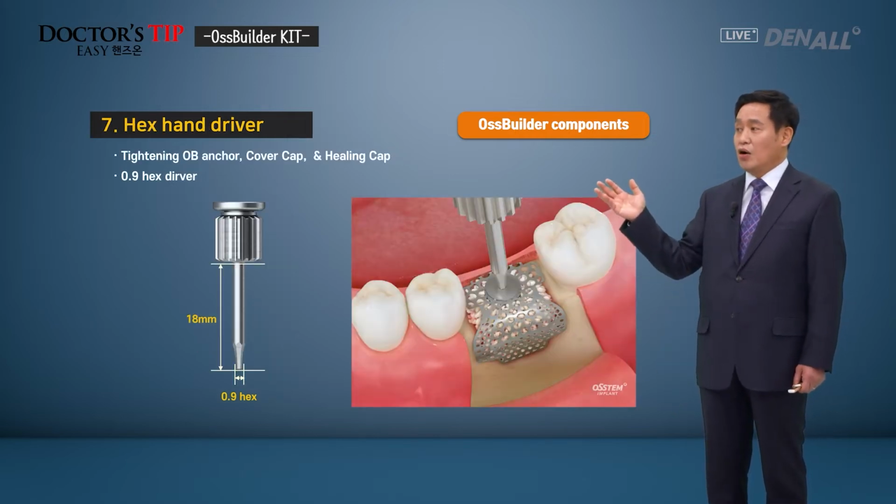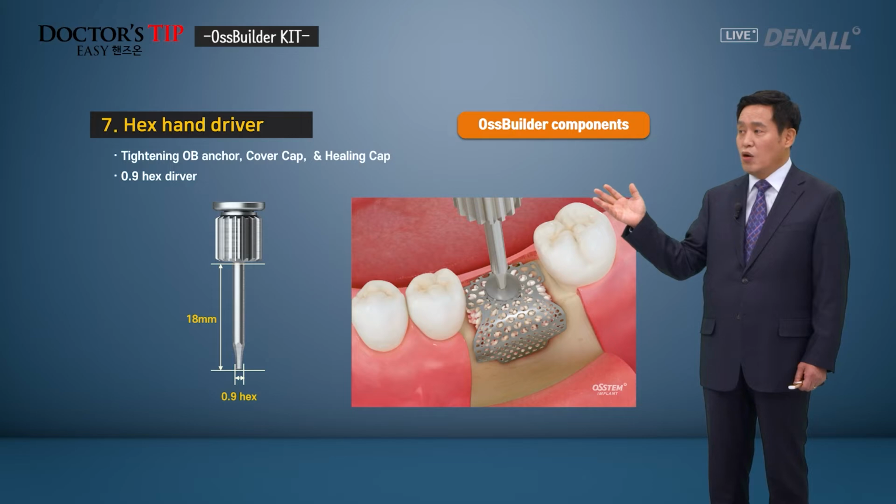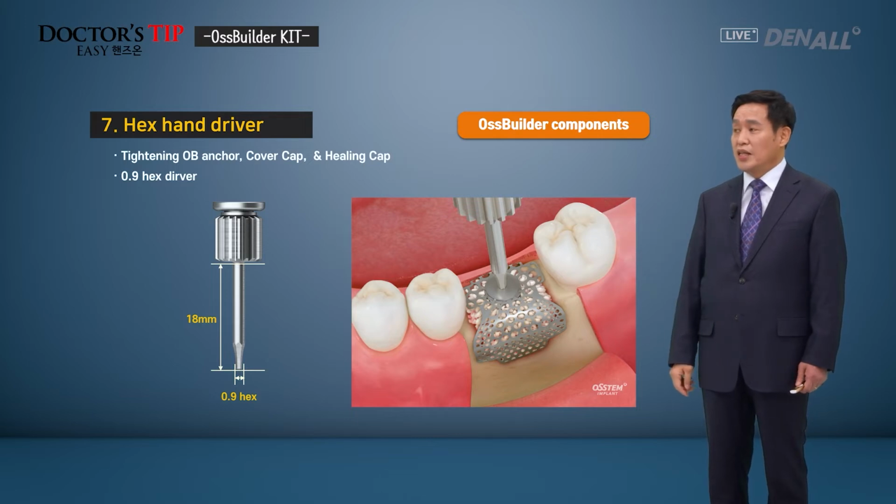The next is the hex-handed driver. Of the hex-handed drivers available these days, I use 1.2 when I place implants, and there's a 0.9 hex driver. You can use this for connecting the OB anchor, cover cap, or healing cap for OssBuilder.